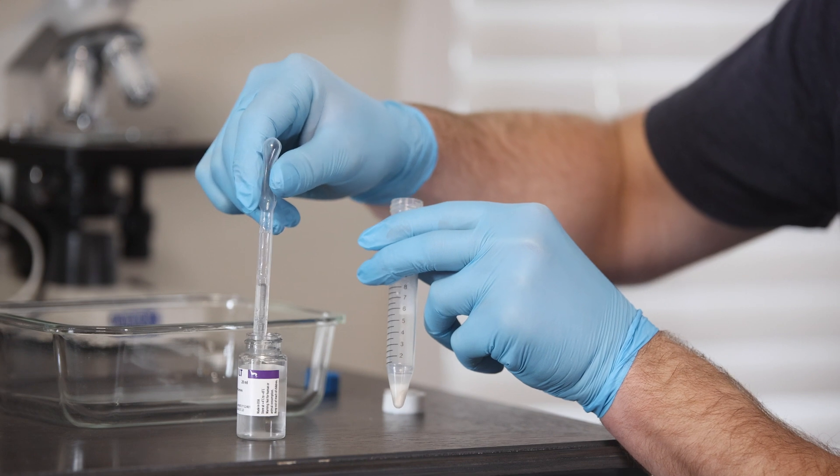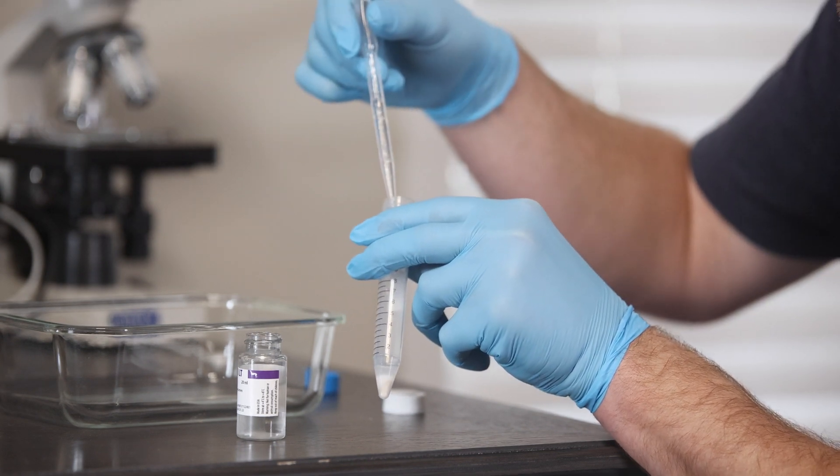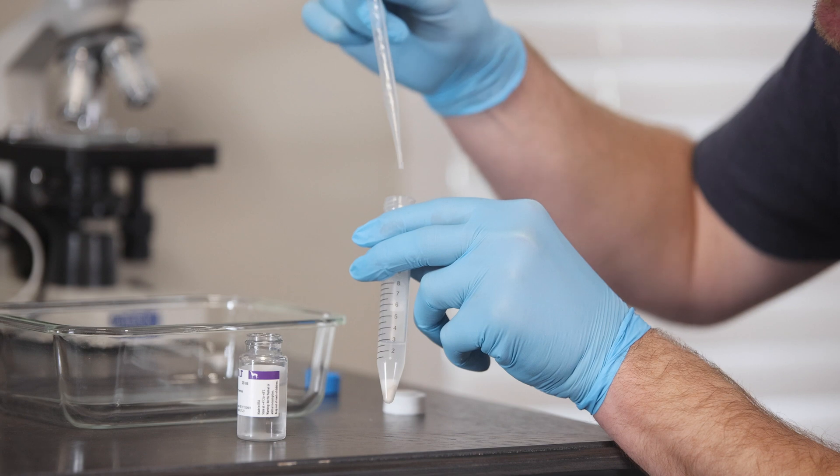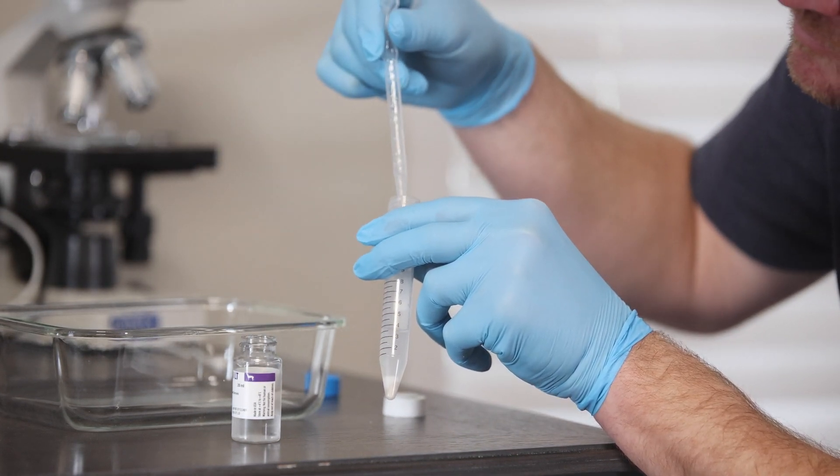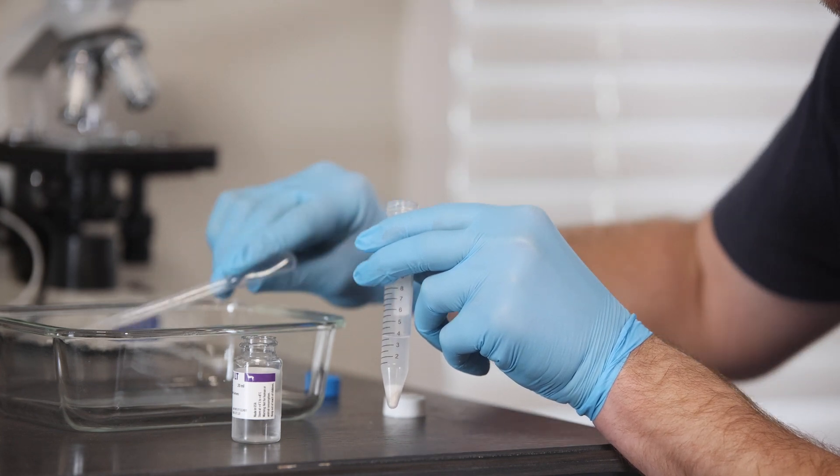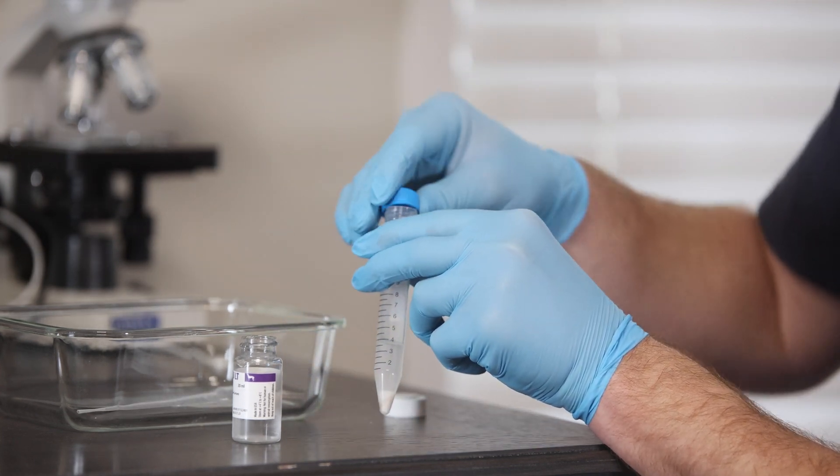Next, we'll add in our extender. Our preference for semen extender is CaniPlus LT, which is the long term extender for up to 10 days. The CaniPlus ST or short term will do the same thing, but it's only good for up to 5 days, which would still likely be suitable for most French Bulldog breedings. These extenders have built in antibiotics and are a ready for use solution.